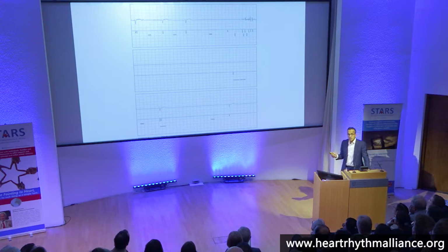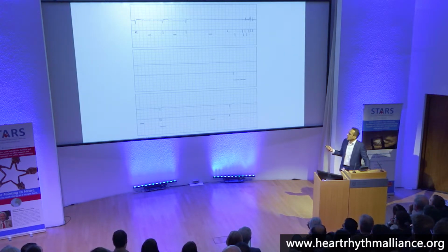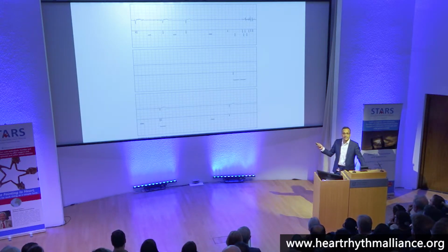Okay. So he came to us with the loop recorder already in, and when you talk to him in the clinic, he's overworked, underpaid, not hydrated, pre-syncopal all through the day, and will faint perhaps once or twice a week. We treated him with lifestyle measures, and this never happened again. Okay, so this is an important lesson: not to act on the first thing you see, and look at the patient first and put this into context.